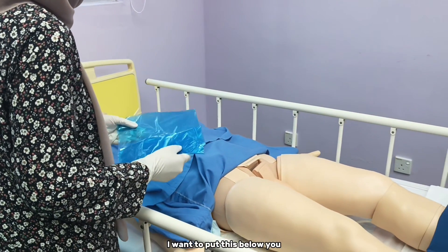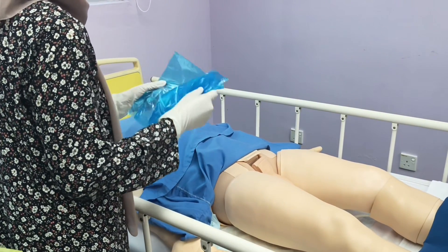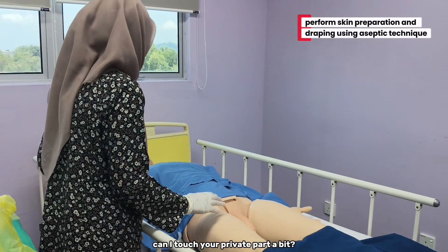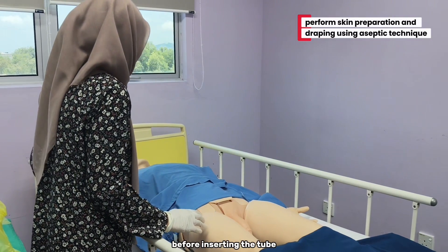Can you lift your hip a bit? I am going to put this below you. Can I touch your private part a bit? I need to clean it first before inserting the tube.